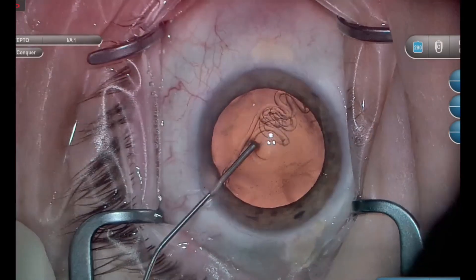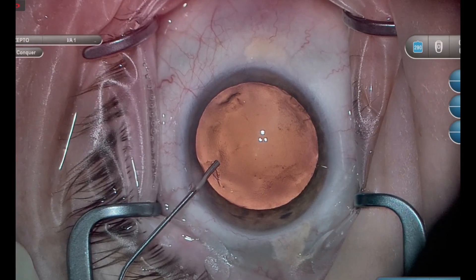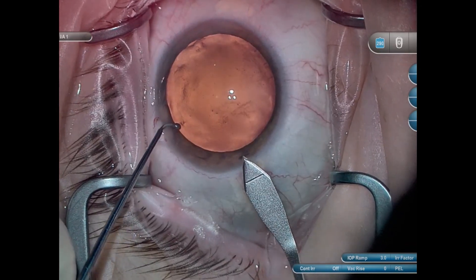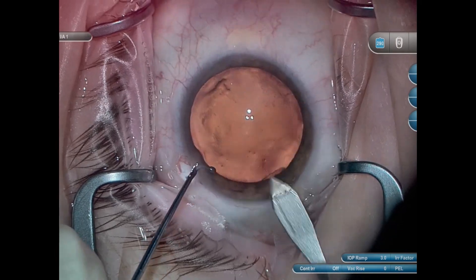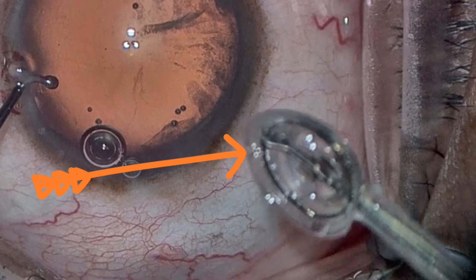When using the Zeptoe, you want to make sure that you inflate the anterior chamber thoroughly with viscoelastic. I'm not a huge fan of overinflation, but when using a Zeptoe, I like to make sure that I have enough space within the anterior chamber for the tip of the Zeptoe. Go ahead and make your incision like you normally do. The folded tip of the Zeptoe is 2.2 millimeters, so you have to use at least a 2.4 millimeter incision, which is what we use here. You then want to inspect the tip of your Zeptoe to make sure that the pushrod is engaged with the nitinol ring.